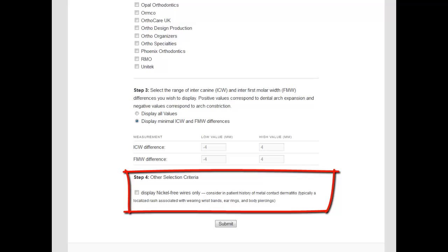The last section allows users to restrict display to nickel-free materials. This is for those patients at risk of hypersensitivity reactions.